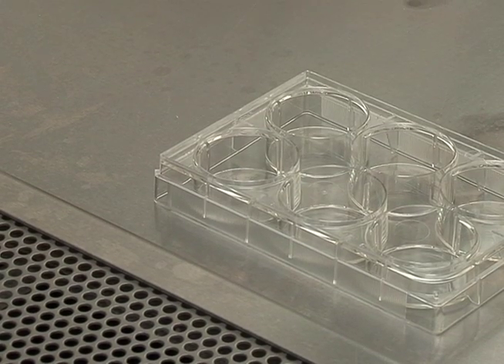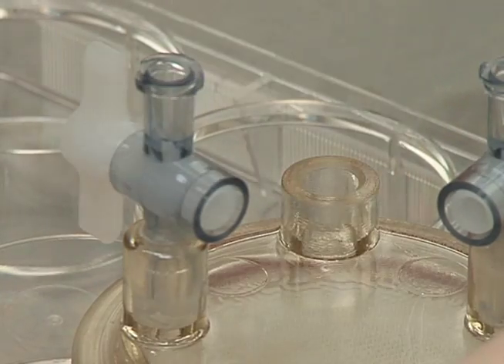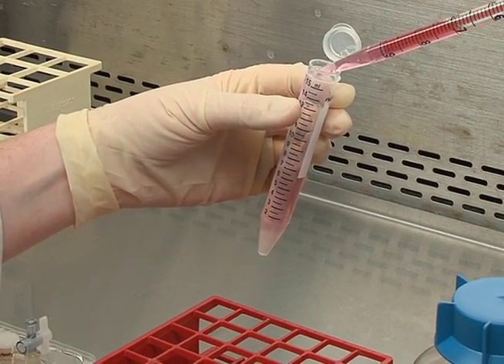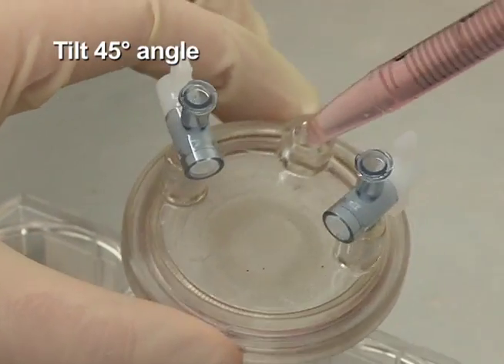Place a 10-milliliter RCCS into a sterile 6-well culture plate and remove the large stopper. Now add warmed GTSF-2 media to bring the total volume of the cell-bead mixture to 10 milliliters and load into the RCCS through the large port.